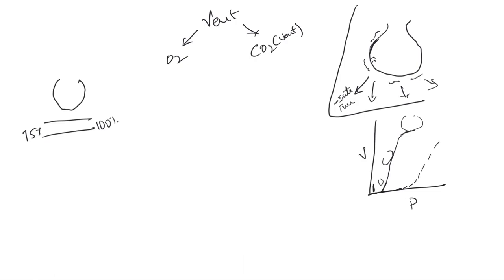And even after you open it, it takes more pressure to increase the size. So this is the abnormal, low compliance. And you never want the alveolus to go beyond these points. For this particular alveolus, you don't want it to reach here, the pressure. This is your opening pressure.